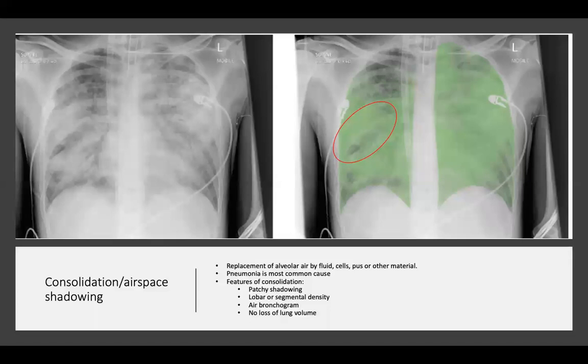This x-ray is an example of consolidation or airspace shadowing. Consolidation is the replacement of alveolar air by fluid, cells, pus, or other material. Pneumonia is the most common cause of consolidation, and it is also sometimes seen in primary TB. Features include patchy shadowing with a non-uniform, not well-demarcated border, lobar or segmental density corresponding anatomically to a lobe or lung segment, and an air bronchogram confirming the density is in the alveoli and not the large airways.